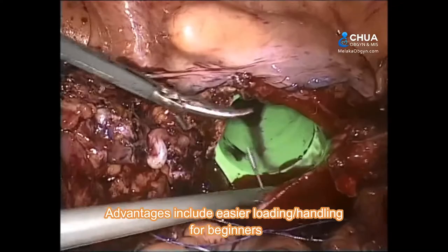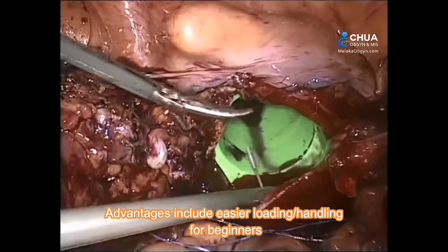For the ski needle, it has a slight curve towards the lateral one-third. It has easier loading and handling for beginners. The ski needle can also pass through most 5mm ports without entrapment and without special technique, just by holding 2 to 3cm posterior to the swaged end.